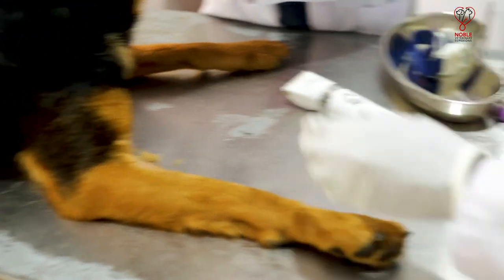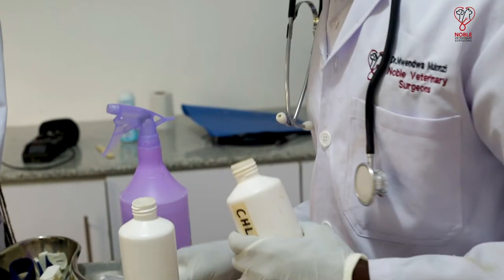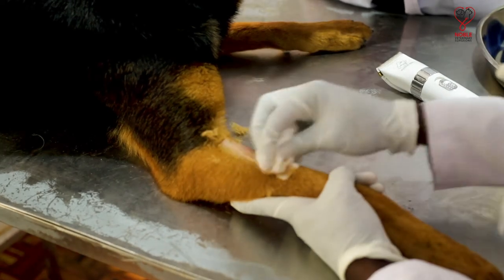After shaving, the site is then cleaned using a disinfectant. This will remove any dirt and bacteria that can cause contamination of the sample.